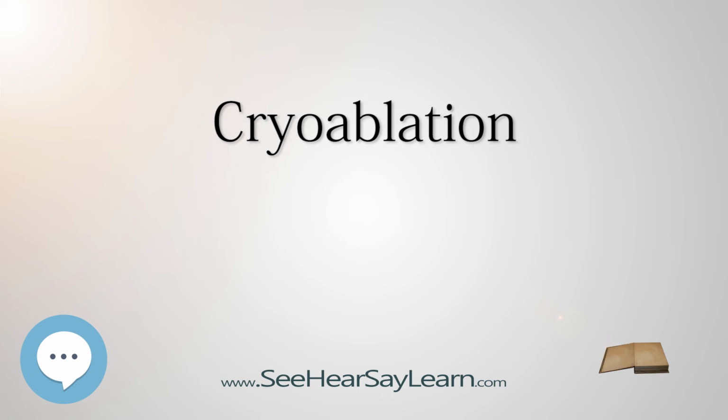At the same time, physicians, including Dr. Ablin and Dr. Gage, started utilizing cryoablation for the treatment of prostate and bone cancer. The 1980s and 1990s saw dramatic advancement in apparatus and imaging techniques, with the introduction of CMS cryoprobe, and AccuProbe.